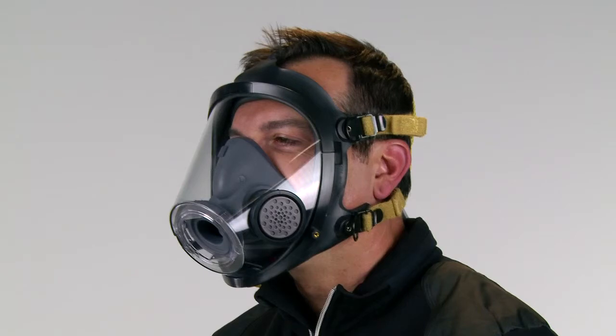If leakage of air is detected, adjust the head straps or facepiece slightly, or the facepiece can be removed and redonned. Repeat the negative pressure leak test and ensure no leaks are present before using.